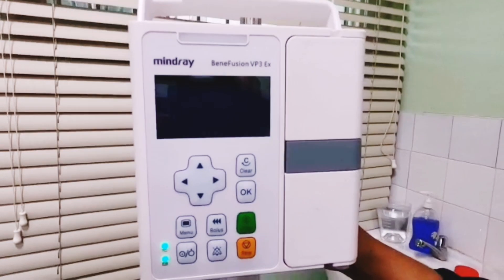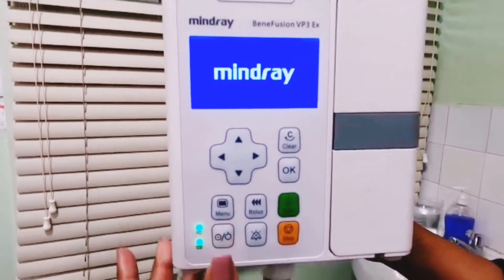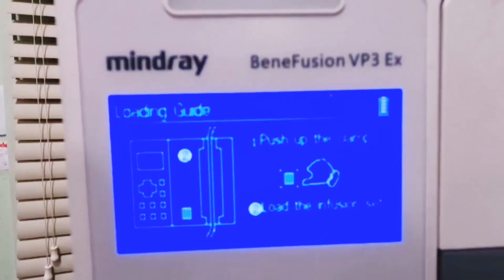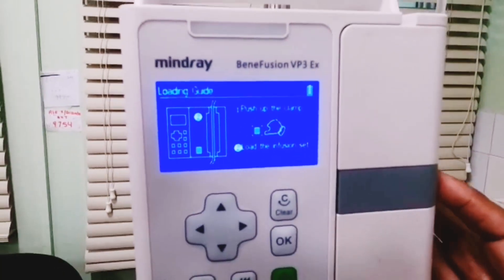The first step is to put on the apparatus — press and hold the on/off button. The system will begin to load. There's a loading guide that will direct you on what to do next.